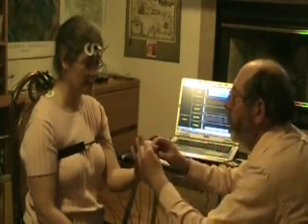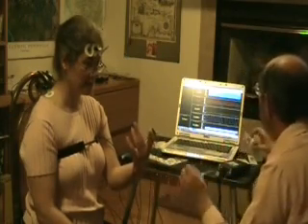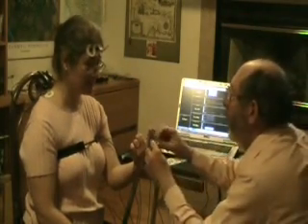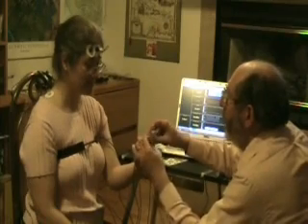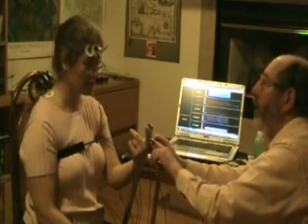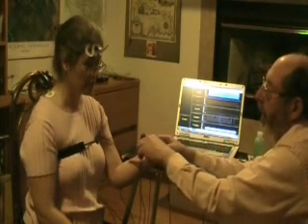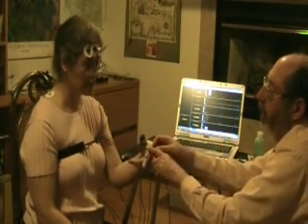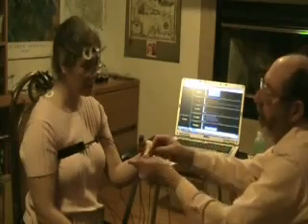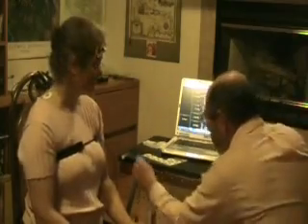So I'm just going to tape this on. This is paper tape that's hypoallergenic, so that it's not trapping the heat in you. The reason I've got this extra piece of tape here is because the stem of the sensor is also picking up heat. And if it keeps changing its position on your hand, that'll change what we pick up here. And of course, if the whole stem wiggles, the amount of contact we get will change. Okay, so just relax. We have one more sensor to put on.